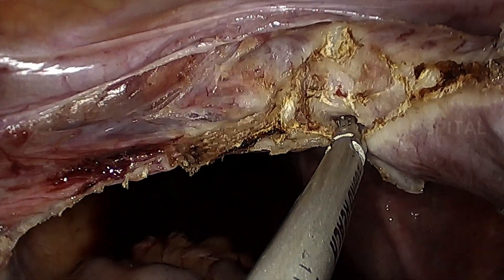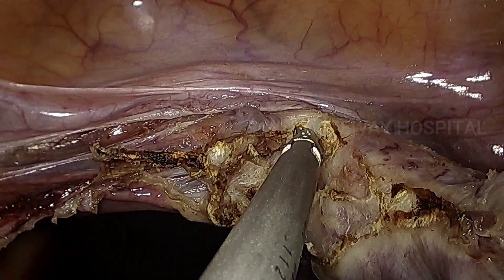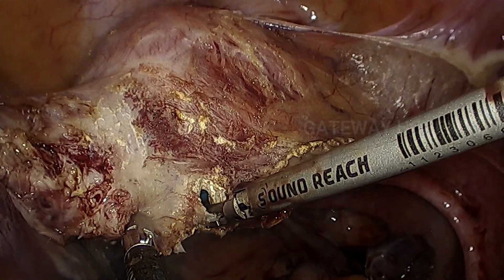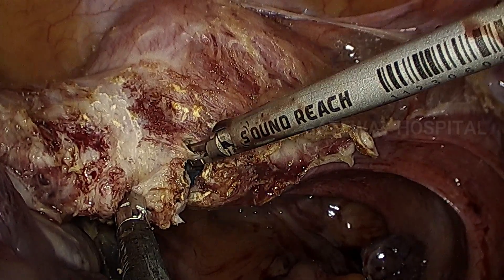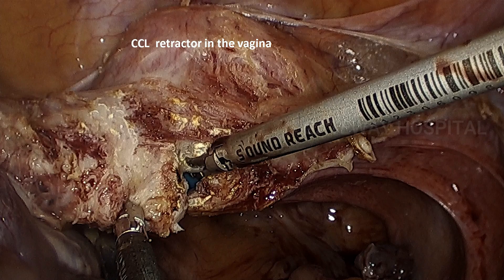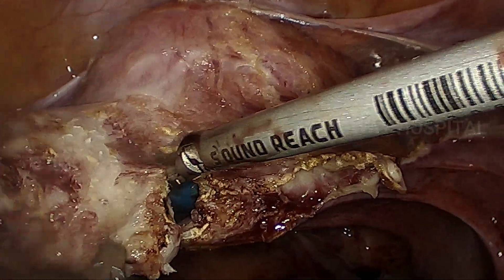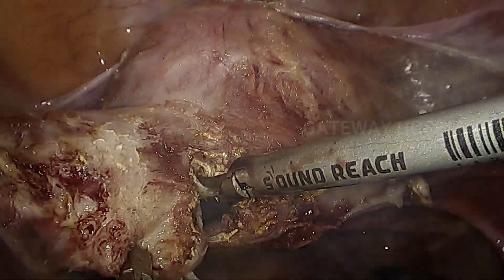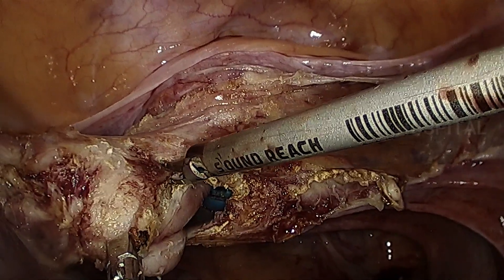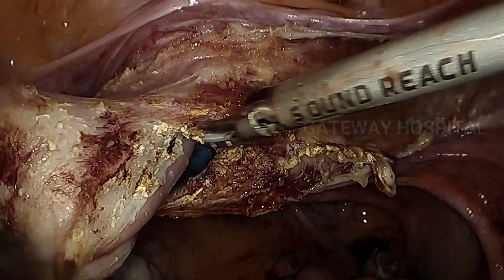We can introduce the CCL retractor through the vagina so that the opening of the vaginal vault will be made much easier. You can see the blue color CCL retractor seen through the vaginal opening, and you can see the bulging CCL retractor inside the vagina. After entering into the vagina, you can slightly withdraw the CCL retractor so that we can complete the division of the vagina at the fornix level using the harmonic scalpel.